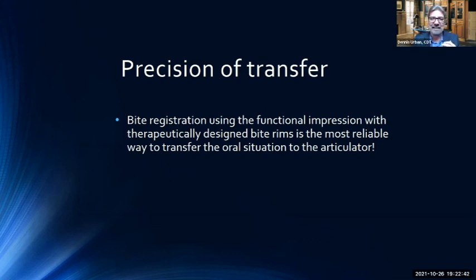But that is a great way, especially with full mouth reconstruction, to get the information we need at the laboratory to give you a full upper, full lower denture, or restoration that's going to probably eliminate a lot of adjustments because of mimicking that true jaw function with a face bow transfer.